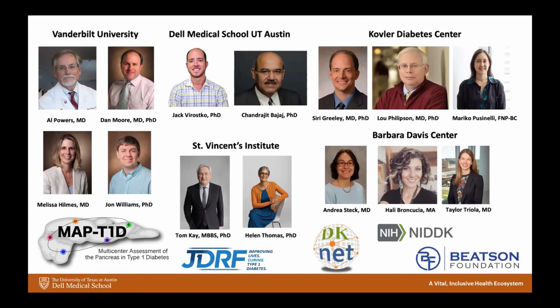Elastography, I think, would be really interesting. I think there are a couple of groups out there looking at elastography, and this actually dovetails a little with what Albert said. So for MR elastography, you're actually applying a kind of shear wave to the pancreas and seeing how it deforms, and it tells you a little bit about the stiffness of an organ.